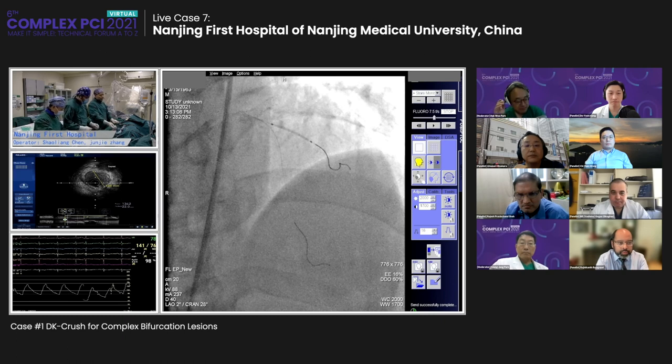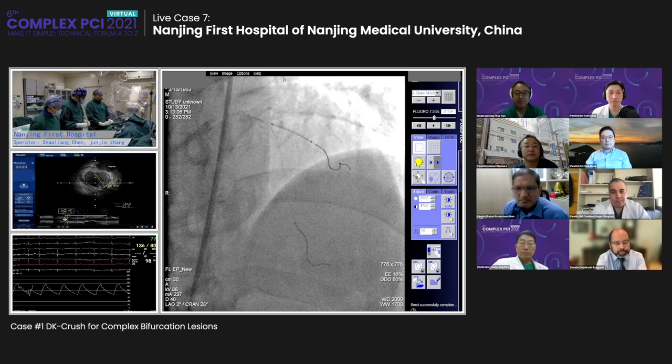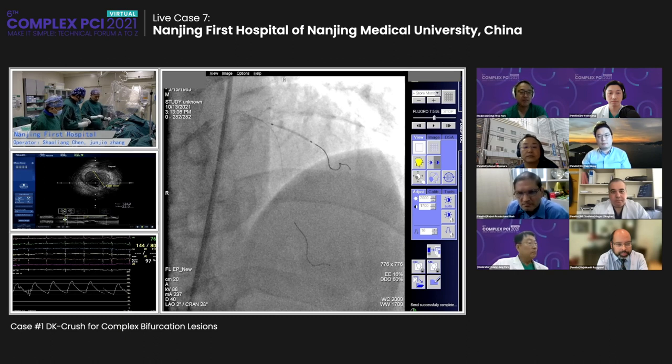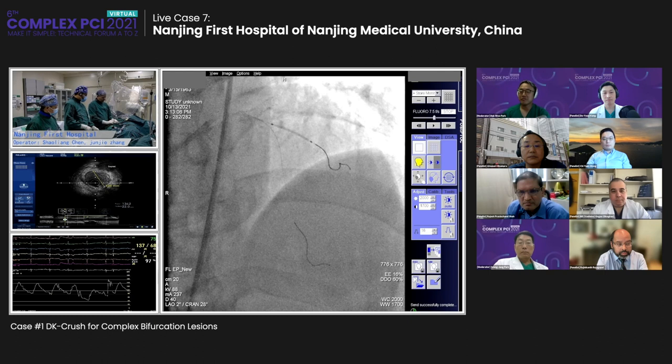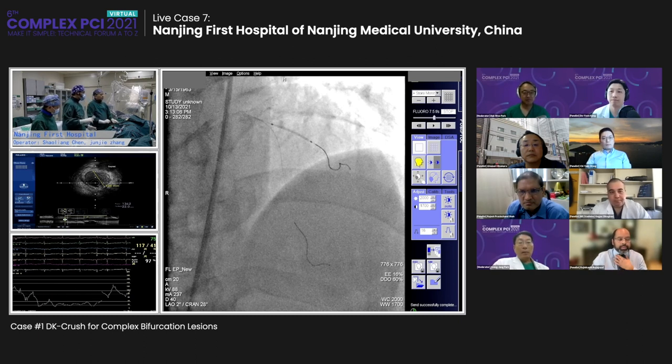Yeah, I think it's another very challenging question. So far, even the drug-eluting balloon is not very popularly used in China. We don't have very strong data to recommend the routine use of drug-eluting balloons for bifurcation lesions. To be honest, we are organizing another randomized trial to compare a drug-eluting balloon for the side branch. So far, we have only included 60 to 70 cases, so probably after 2-3 years, we will provide the data. I think also, for any given bifurcation lesion, we have many different options.